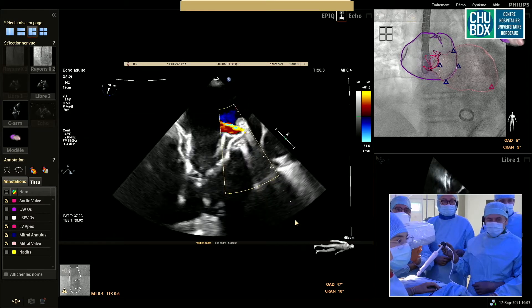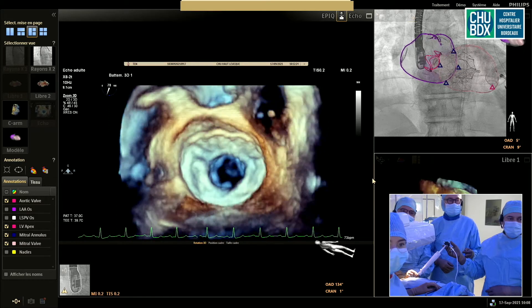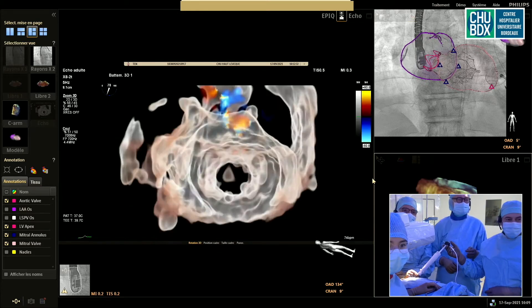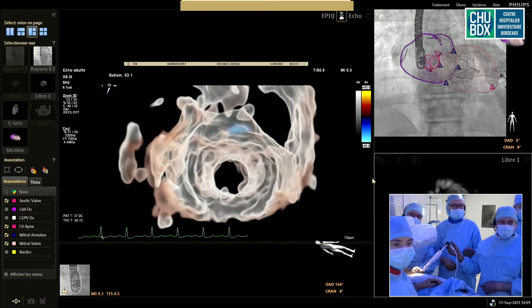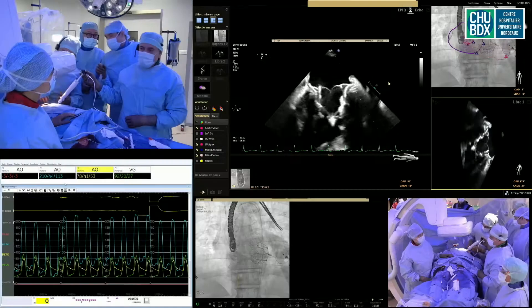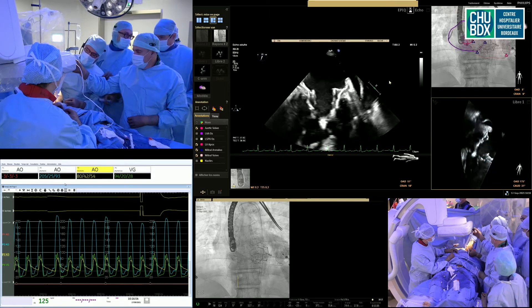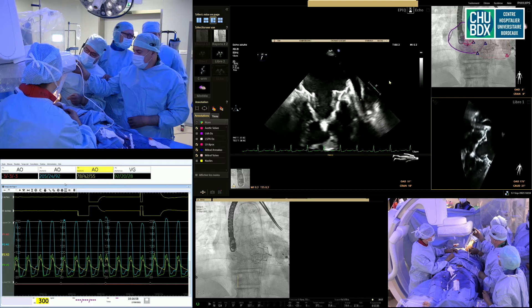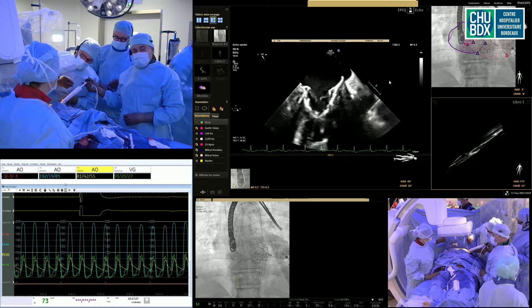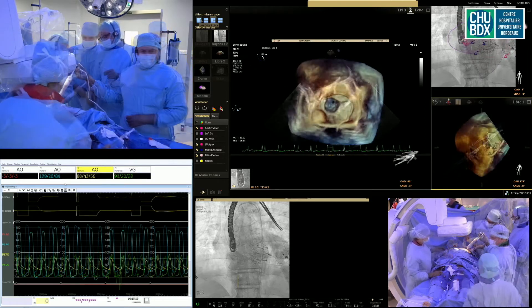The position is echo-driven, so you need a good connection and direction with the images. This was a very nice sample — you could do this in 25 minutes. And under the pressure of a live case, congratulations to Bordeaux. Here was the leaflet of the porcine valve. Very central flow, very nice. We can also notice that we are at 30 minutes. It's more than usual because of the live. We're going to finish the procedure. I'm going to tie my sutures. The patient is not bleeding. The pad secures also the apical axis — this is also one of the advantages of this valve. The pressure curves also look nice. A strong demonstration. Thomas, congrats — that's a really beautiful case.